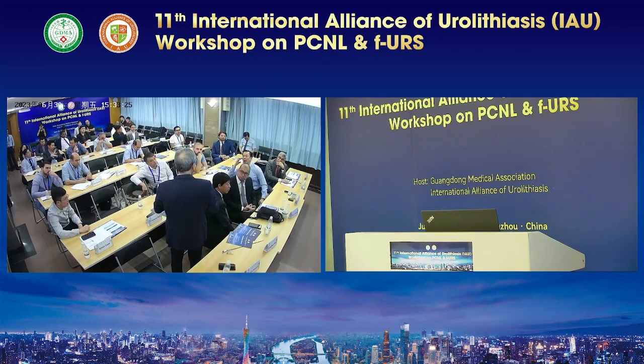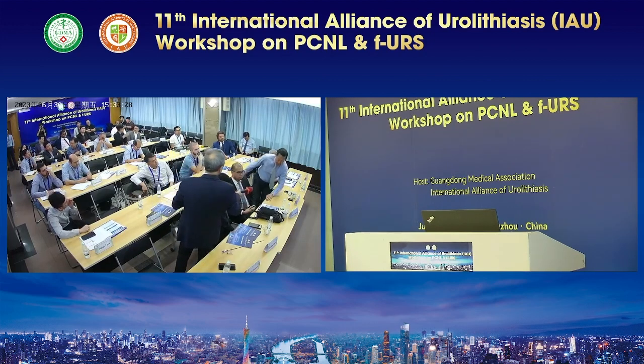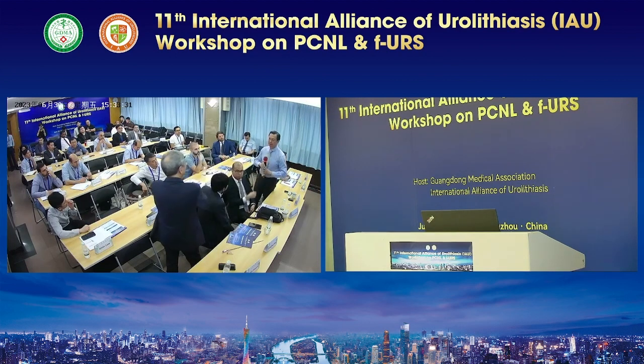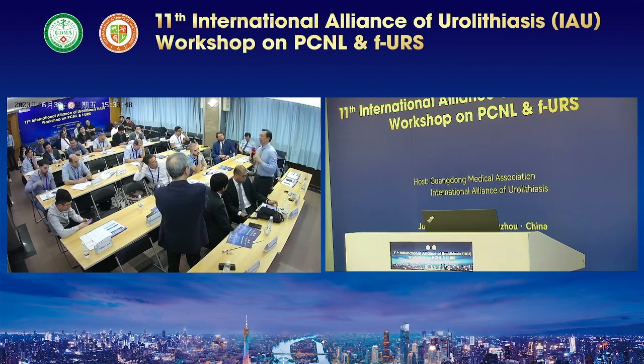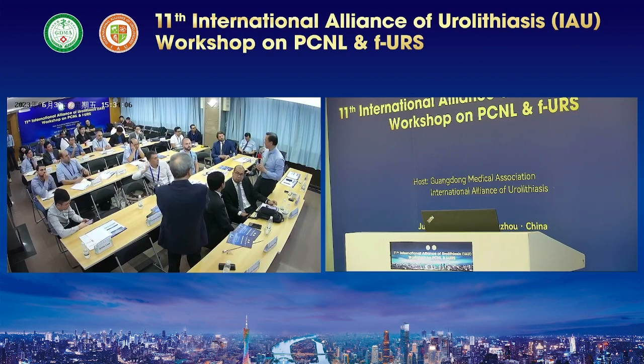And for you, which method? We like to pre-puncture. So if you've got a complex staghorn stone, and you know that the first puncture is coming in this way, and you know that there's a big stone that's completely parallel, that you won't be able to get to it, we would pre-puncture, get a guidewire down the ureter. Because after the first operation, after removing the big stone, sometimes there are blood clots, air, gas, perinephric collection, and then the second access can be more difficult. Yeah.